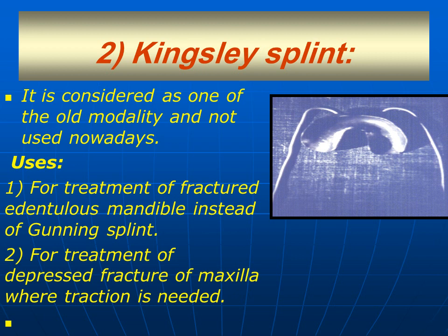Why shorter than the anatomical outline? To ensure that the tissue conditioning material is covering all the borders and it will be gentle for the patient during the period of fixation, which is about 45 days until healing takes place.